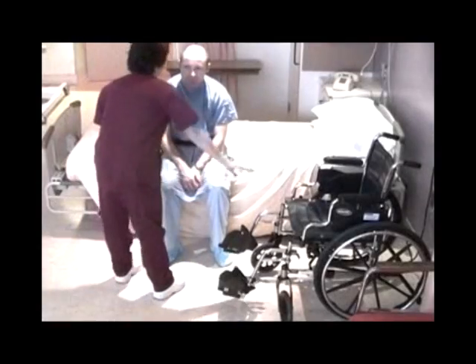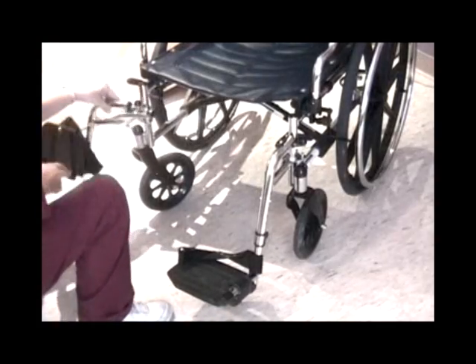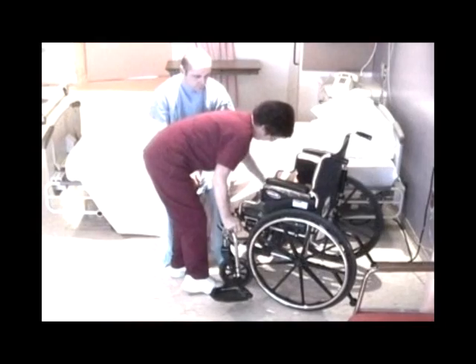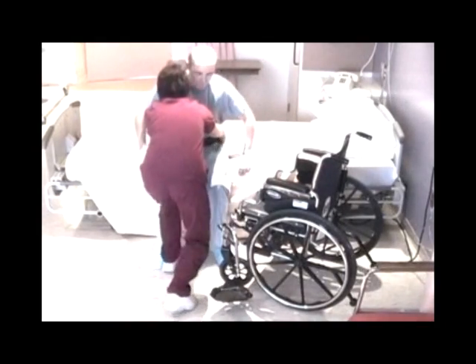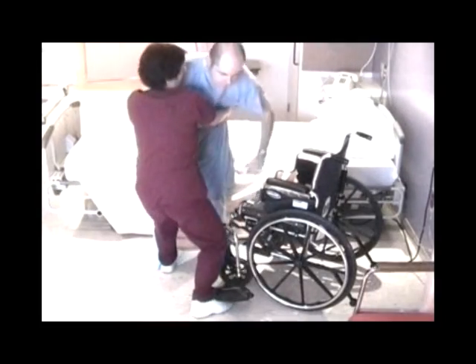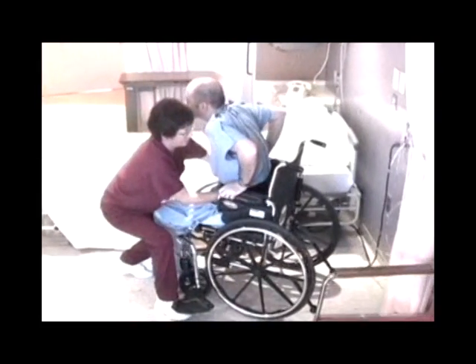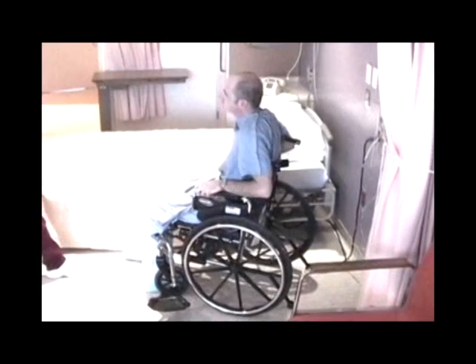Procedure for one-person transfer using the transfer belt. Remove or swing away the footrest from the wheelchair. Stand facing the patient. Place one foot between the patient's feet and the other foot behind you in a wide stance to provide a sturdy base of support. Grasp the transfer belt. Instruct the patient to push off the bed with their hands. Instruct or assist the patient to place both hands on the armrests and to sit slowly in a smooth, controlled motion.